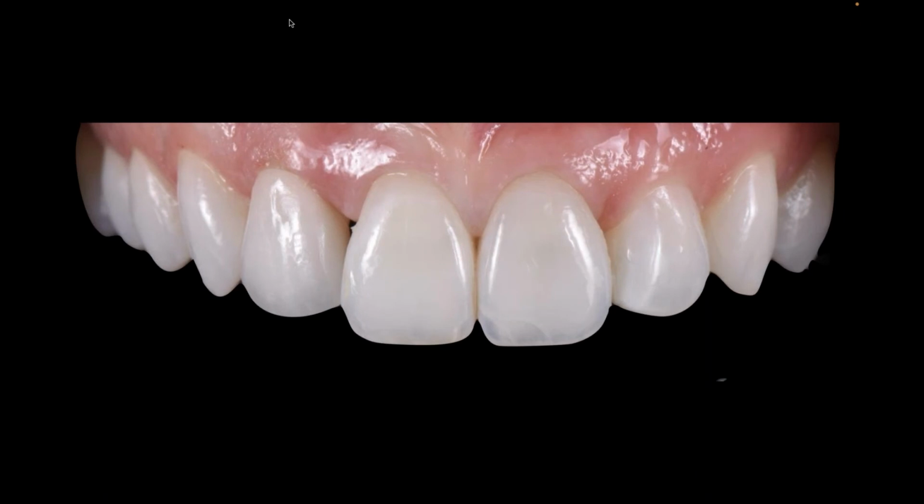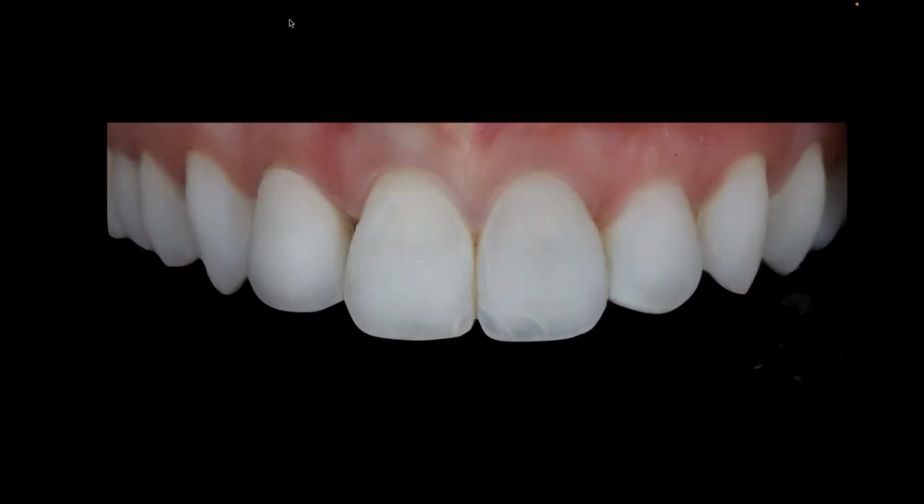Pretty close. I wouldn't say it's perfect, but close enough. And then you'll notice on the polarized, it actually looks a hair brighter, but again, pretty close. I don't know if it was cemented at this point. So this is where it's really more challenging, right?